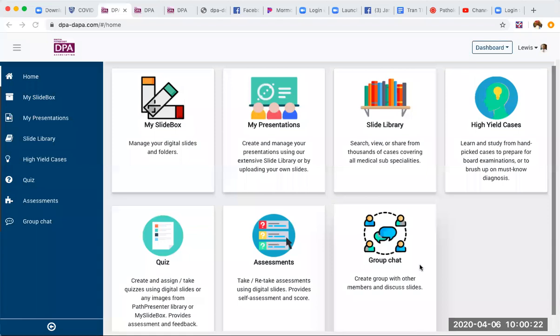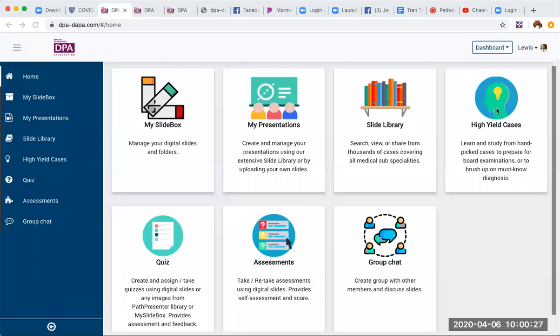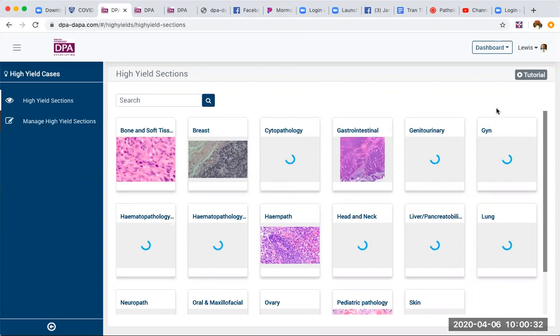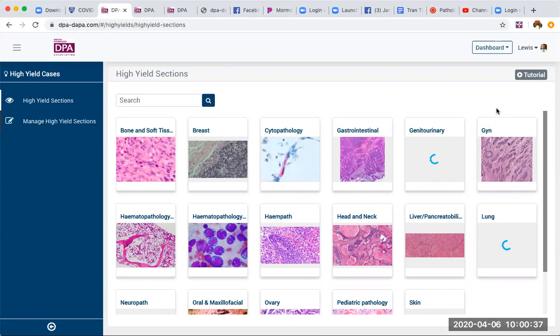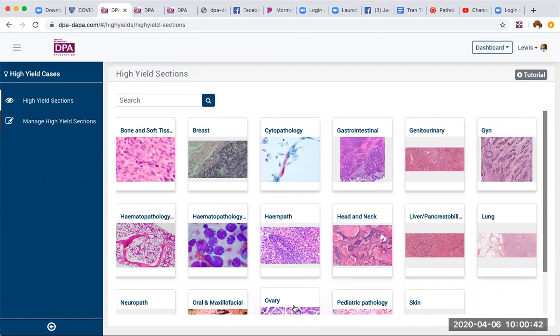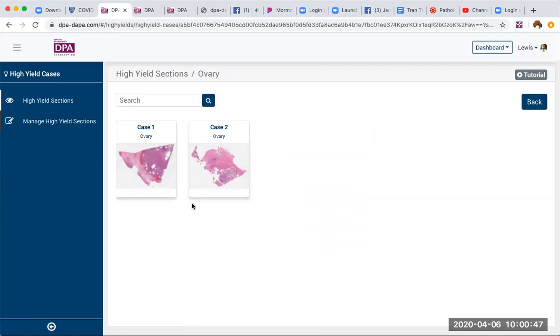Welcome to the digital slide box case of the day. We're going to talk a little bit today about a gynecologic tumor in this test orientation. Here you see the high yield sections with a variety of different options, and we'll go to a case in the ovary section that we entered a few weeks ago.